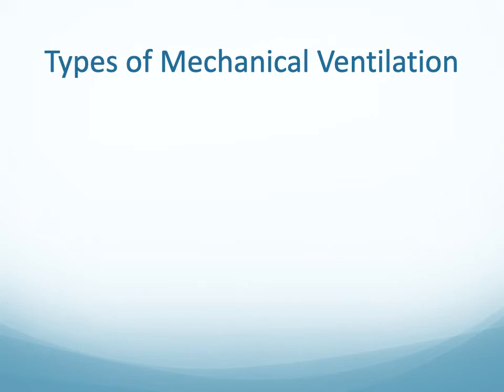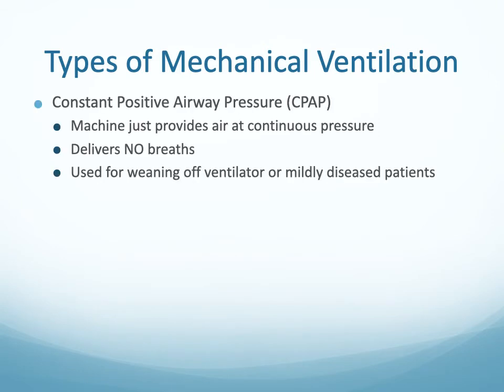The next type of mechanical ventilation is CPAP. With CPAP, basically it's just air that's flowing in through the tubing at a continuous pressure.